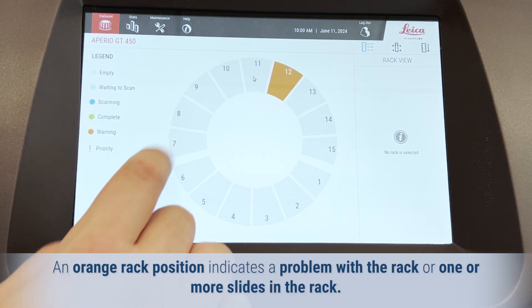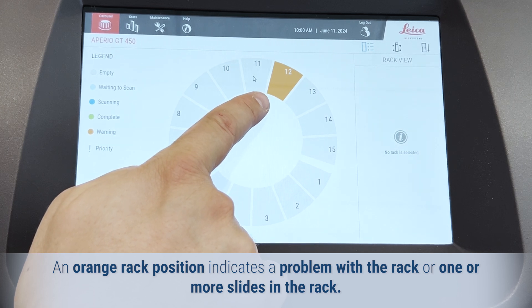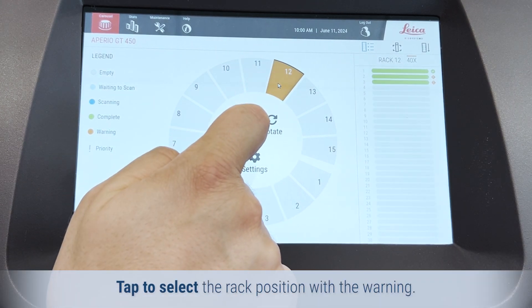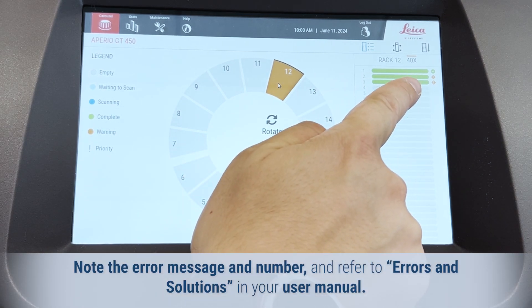An orange rack position indicates a problem with the rack or one or more slides in the rack. Tap to select the rack position with the warning. Note the error message and number and refer to errors and solutions in your user manual.